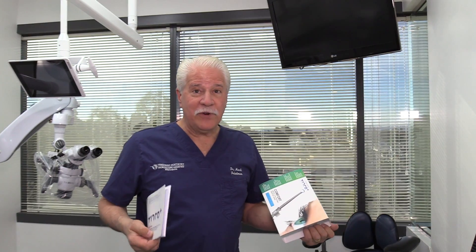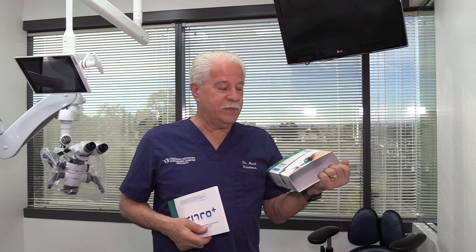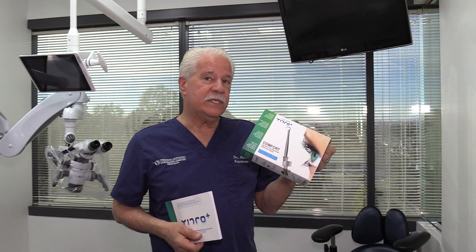Hi, my name is Mark Friedman here at Friedman Dentistry. Dr. Matt Friedman and I have just taken possession of a Yirro Plus comfort mirror system.